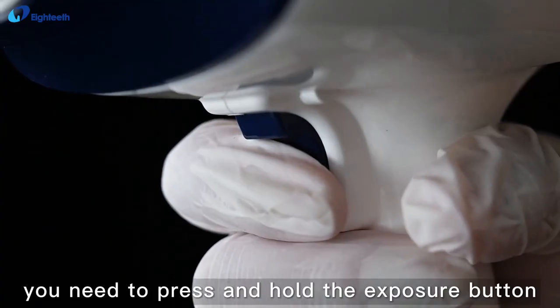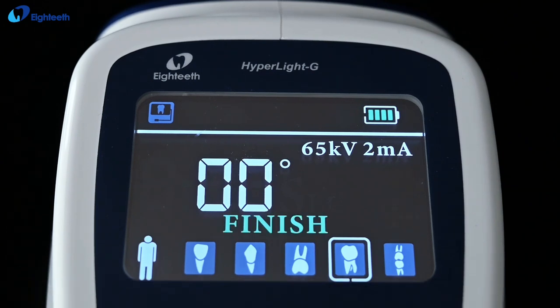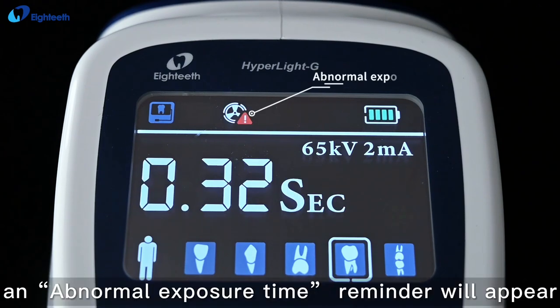During exposure, press and hold the exposure button until 'Finish' appears. The image will come out. If not, an abnormal exposure time reminder will appear.